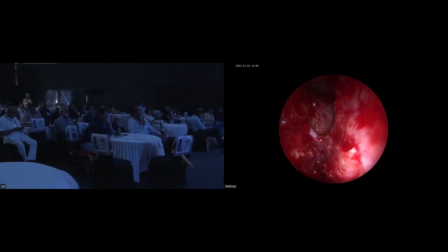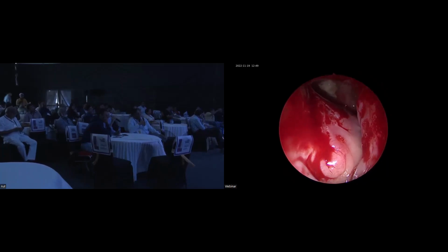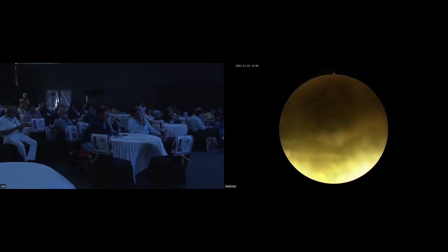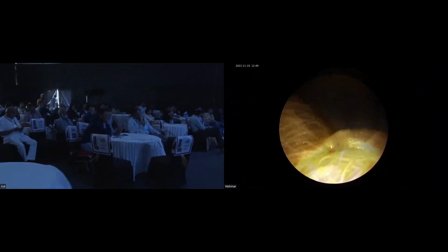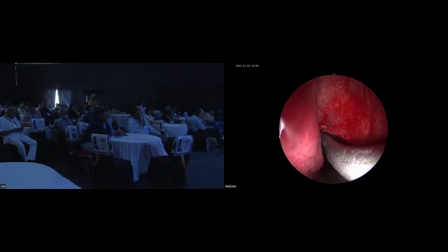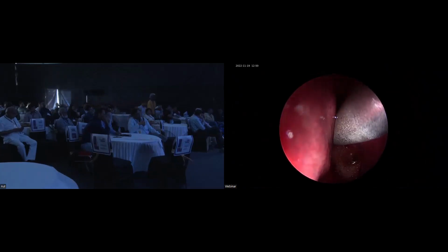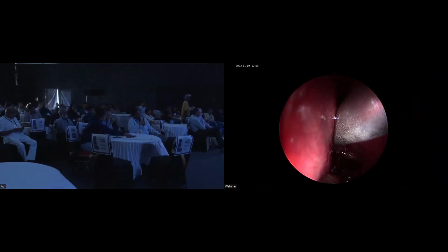In fact, I told you that Satish told me to remove it. I am not able to reach there very easily. I gave wash also. If I had a 90-degree suction, I can easily reach there. They don't have. Hole band kar, hole band. इकडचा hole band.